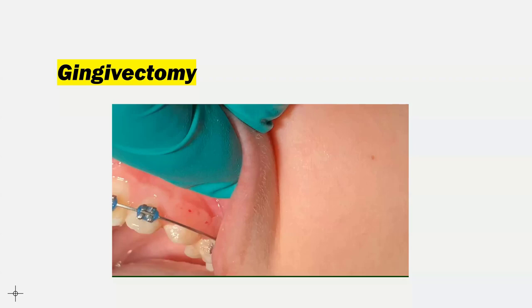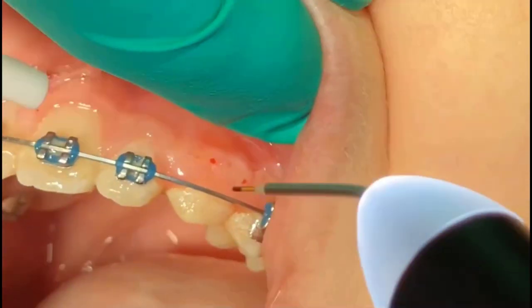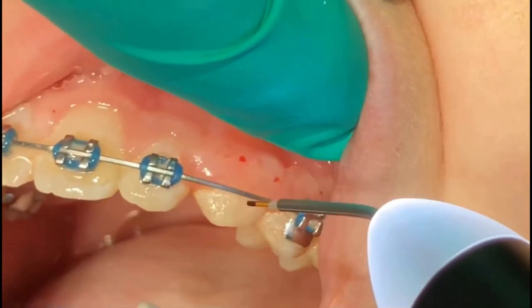Gingivectomies. So obviously during orthodontics, gingivectomies become a vital part of treatment. And the reality is that it's simple to do with a diode. So one of the things you could see here is I got the patient numb, and then I took a perio probe and I made two little dots there. Actually, one in the middle. We do that because I've measured with a probe how deep the probe goes. I'm going to stay within what I hope is biological width, and I'm going to remove that tissue.